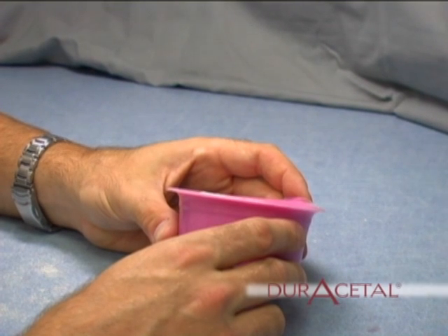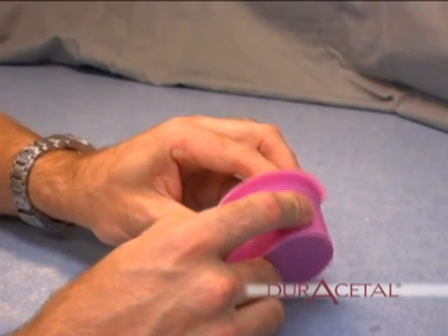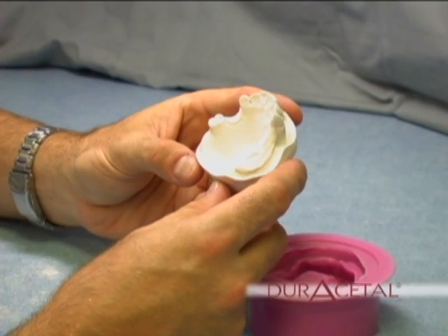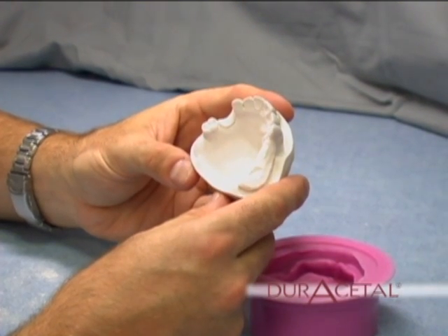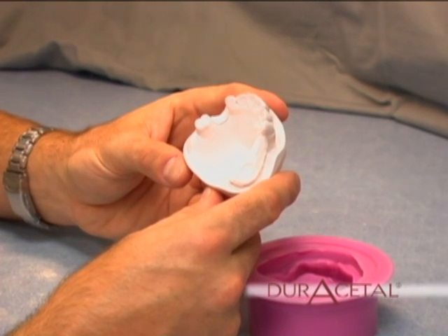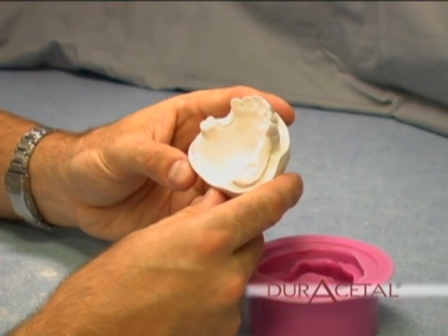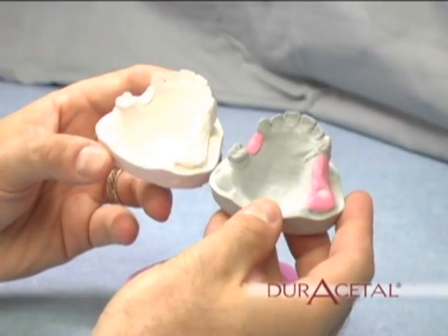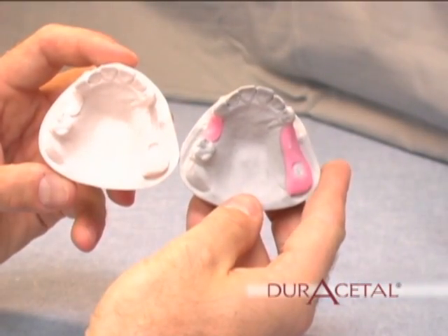Pour up the duplicated mold using Sedium Dental's expansion stone. Be sure to use expansion stone, because duracetal shrinks as it cools, and these stones counteract the shrinkage. If a more passive fit is needed, like with a night guard, Sedium Dental has a double expansion stone. Here we have the blocked out master model next to the expansion stone duplicate.